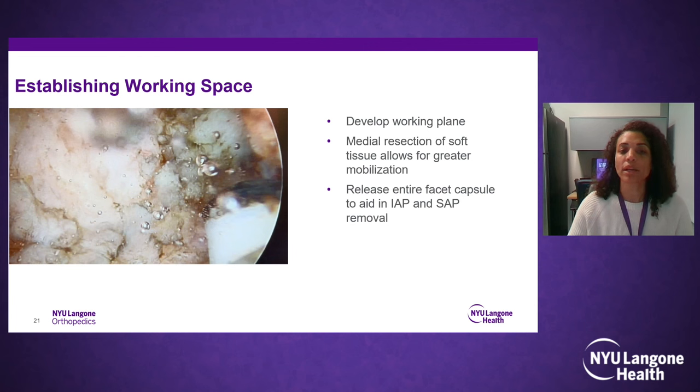There's usually a couple of areas that are a little challenging to get, and it's usually the top and bottom of the facet. Those areas, you kind of have to come around to the caudal aspect to really release that bottom part, and then the cephalad aspect to really release the top part. But once you release that, then you can come around laterally, and then you've got your whole facet joint released.